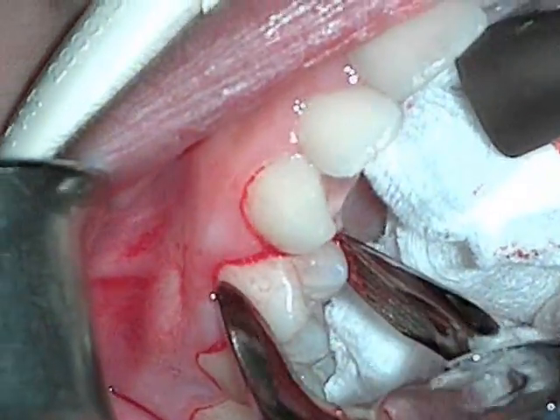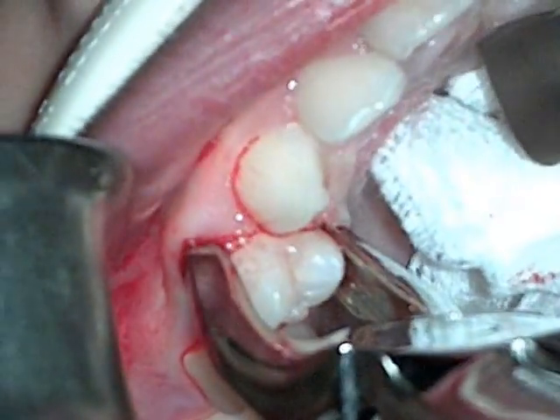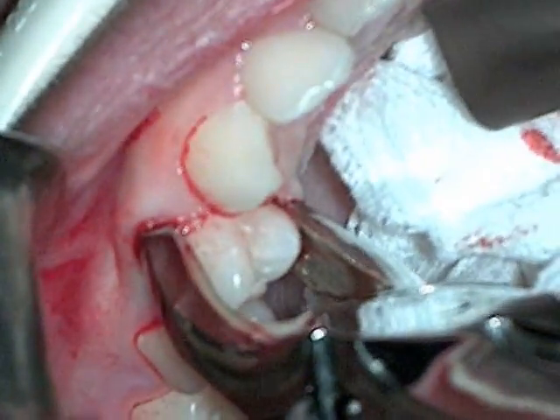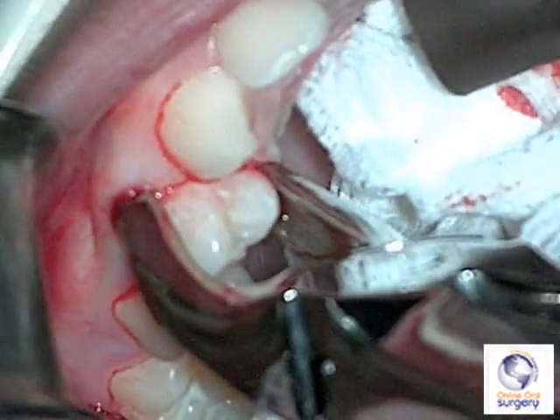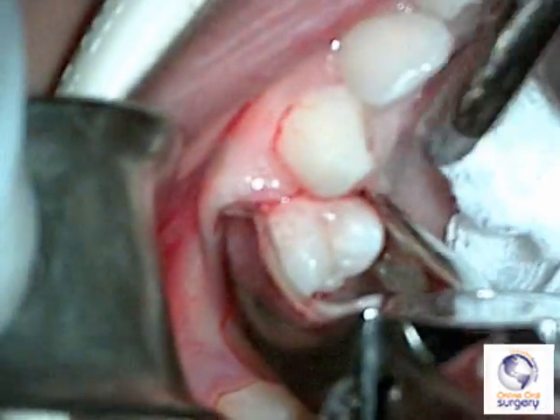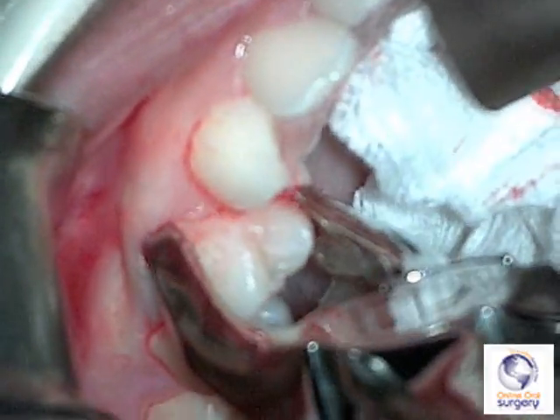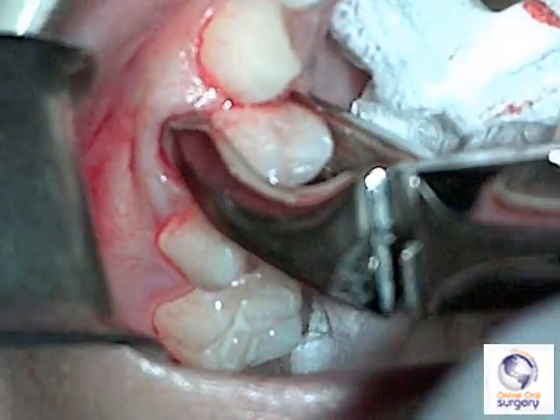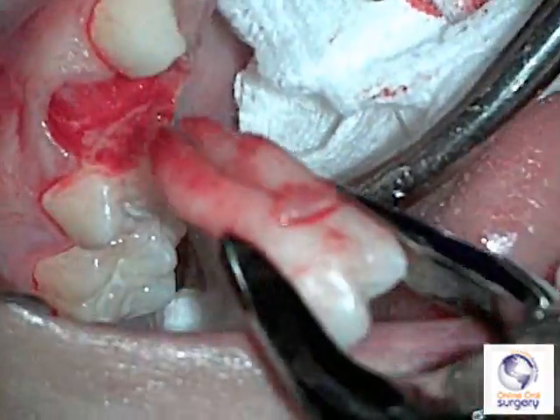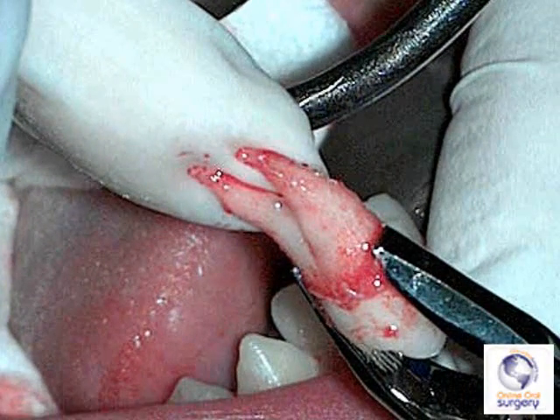Here, an upper universal apical retention forceps is used to remove a maxillary first premolar tooth for orthodontic purposes. You can see that the beaks, being very thin and tapered, are able to be advanced down underneath the mucosa and as far apically on the tooth as possible, which allows you to get a good purchase and good mechanical advantage in order to luxate the tooth to the buccal and the lingual, expand the alveolus, and remove the tooth with very little difficulty. You can see that where the apical retention forceps grabs the tooth is actually further towards the apex than with a standard upper universal forceps.